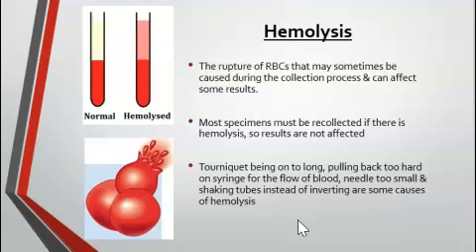Also, when you're mixing your tubes at the end of the venipuncture, make sure you're inverting your tubes. You don't want to vigorously shake your tubes to mix them with the additives, because vigorously shaking the tubes can also sometimes cause hemolysis of red blood cells.